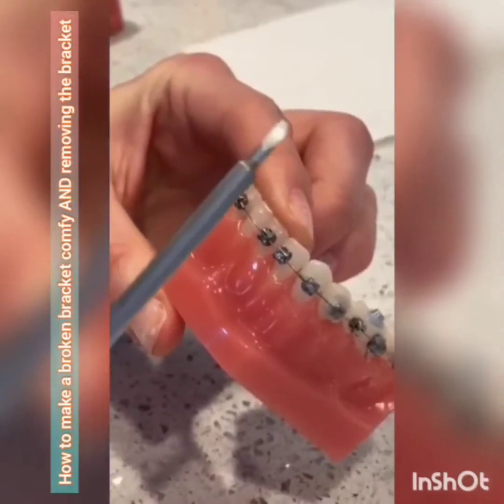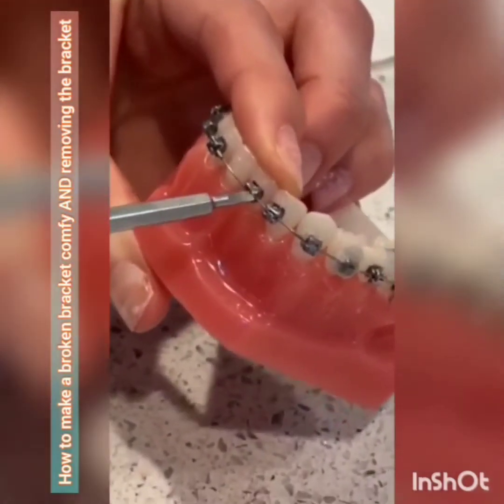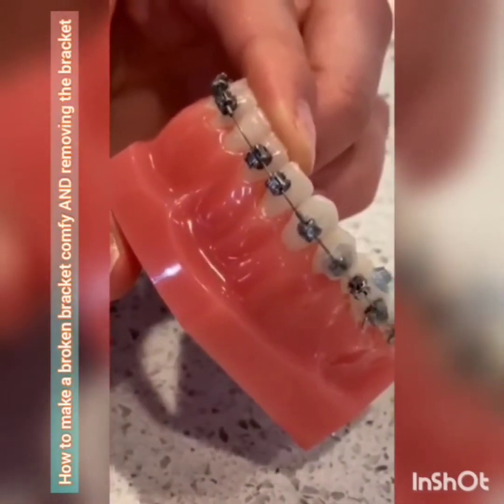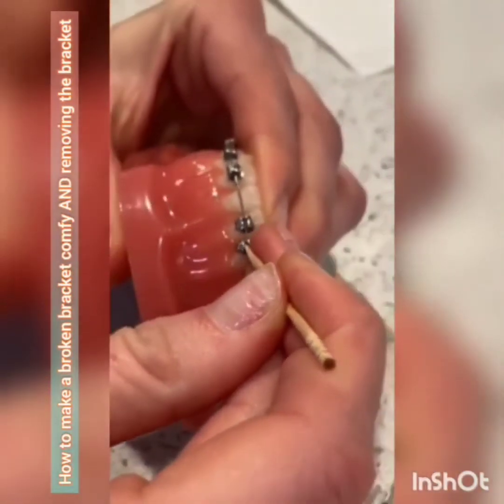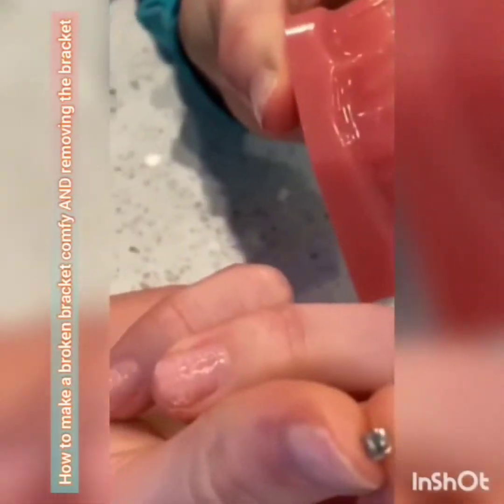And then if you want to actually take the bracket completely off the wire, you can use a small flathead screwdriver or a toothpick. You can use it to open the doors, always pressing down on the garage door. Place it in the slot, open, and then it actually lets it free, like so.